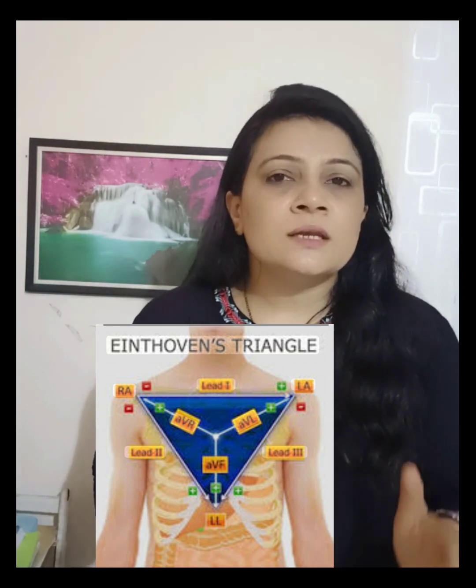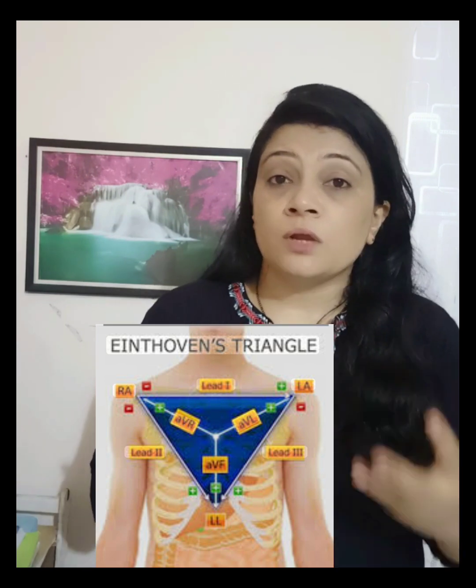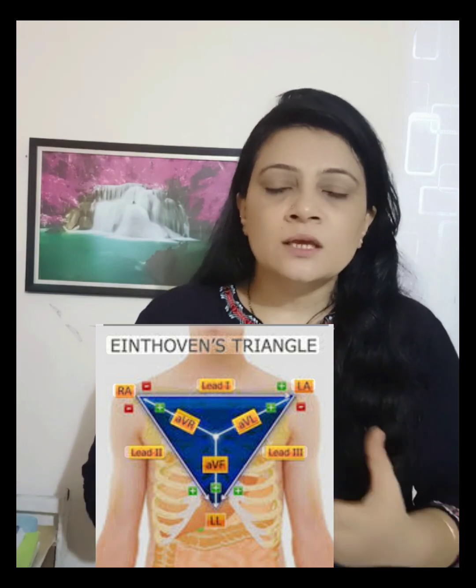Okay, now understand all these things with the Einthoven triangle. This is an invisible triangle, but it is very important for understanding the different leads. I'll help you understand some of the important ECG basics.